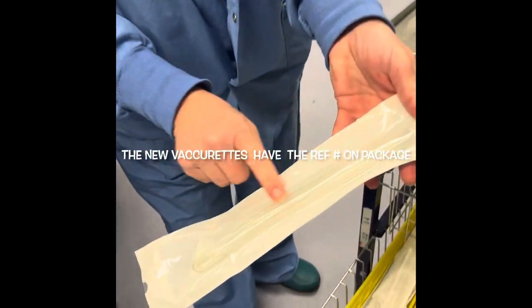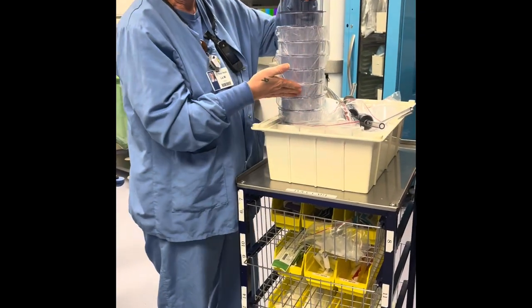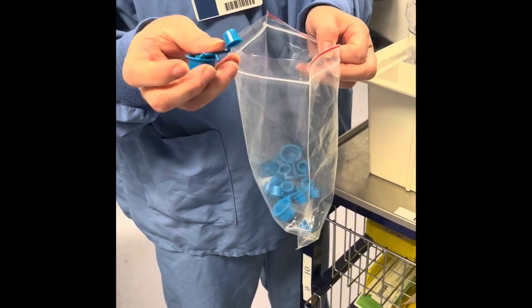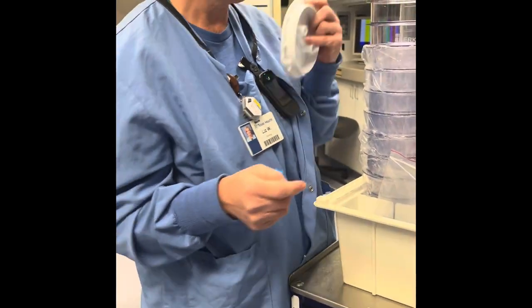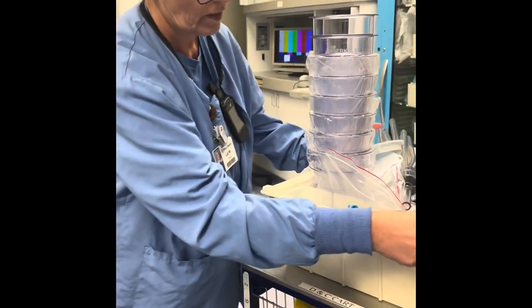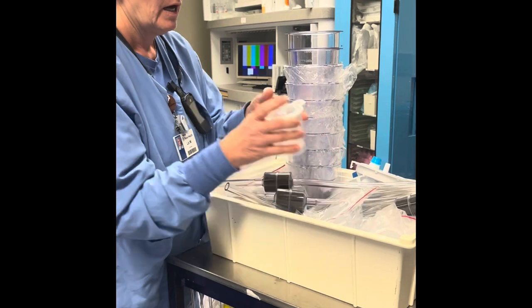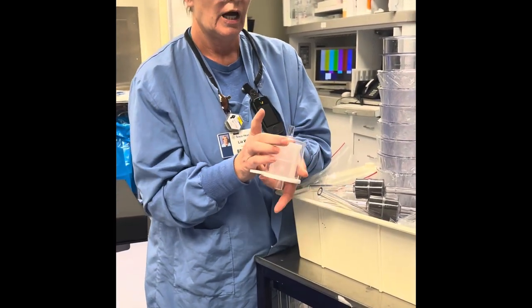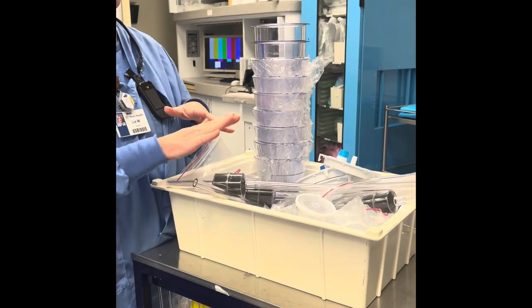Also opened sterilely. Some of these packages, as you can see, are empty right here, so make sure your nurse gets your package. Up here you have your canisters, and then you have your attachments that will go in the different parts of your canister lids. You also have your filter tubing and your filter canisters, and this is what your specimen will go into and will be passed off as specimen.